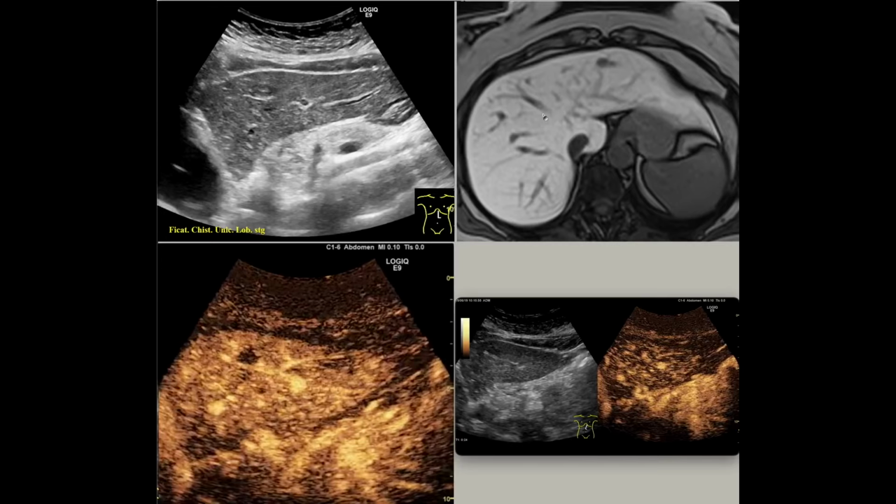Simple liver cyst, located in the left lobe, segment 3, a situation frequently encountered in practice. Subcentimetric lesions are identified during trivial ultrasonographic or imaging investigations, whether or not related to the patient's complaints. Not rarely asymptomatic. In this case, we start with a grayscale examination with the convex transducer.